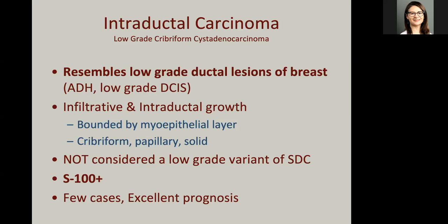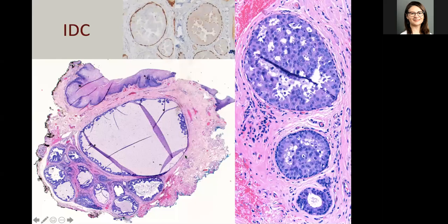Unlike salivary duct, these tend to mostly be confined to the ductal system. So here you can see intraductal growth bounded by a myoepithelial cell layer. Very rarely, these can be infiltrative. I'll show you what that looks like.